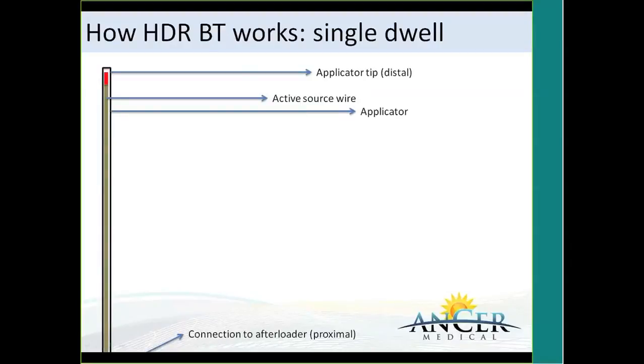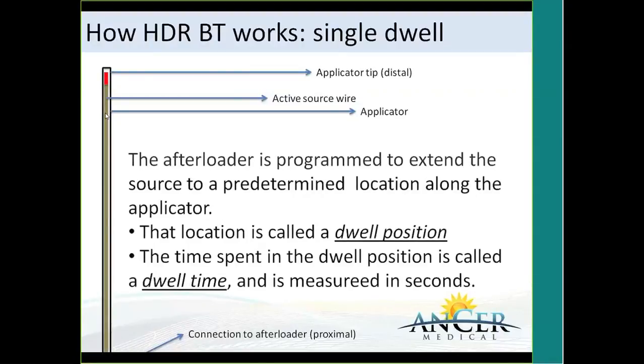The afterloader is programmed to extend the source to any position along that applicator or catheter. This we call a dwell position, and the time spent in that position is called a dwell time. Okay? When you do this type of treatment with a single dwell position, it's considered the simplest treatment. It is used, for example, when we treat skin or when we use a MammoSite balloon with a single dwell position in the center of the balloon.